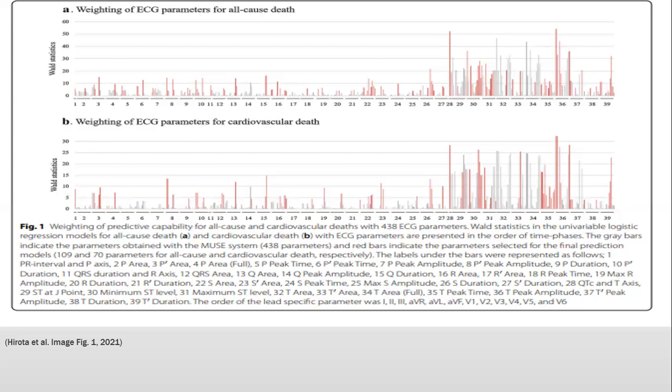It's widely performed for detection and management of cardiac disease. Electrocardiograph enables the evaluation of the risk of cardiac disease in medical examinations. Many studies have shown that electrocardiogram parameters are affected by age. They're going to get different readouts of the heart based on your age.